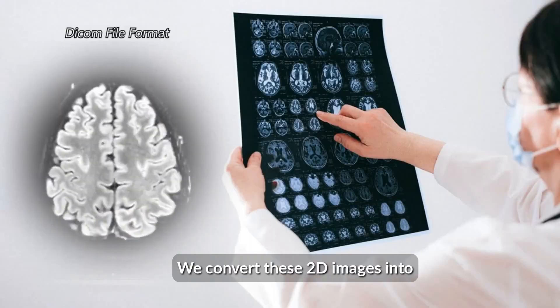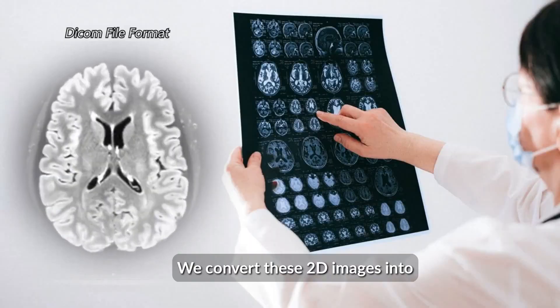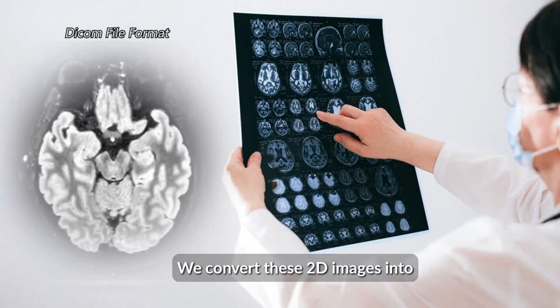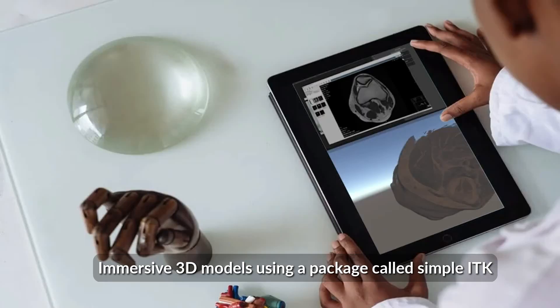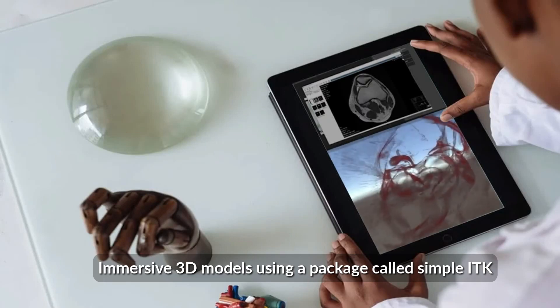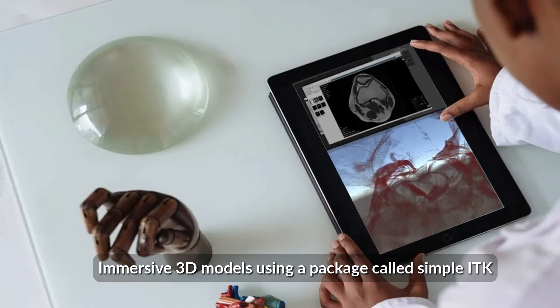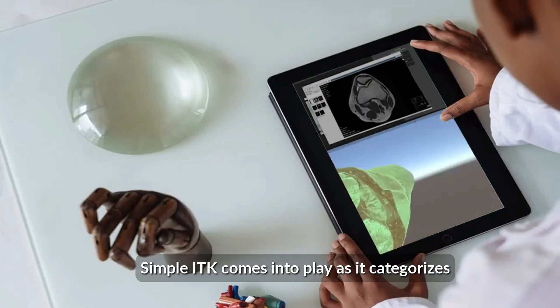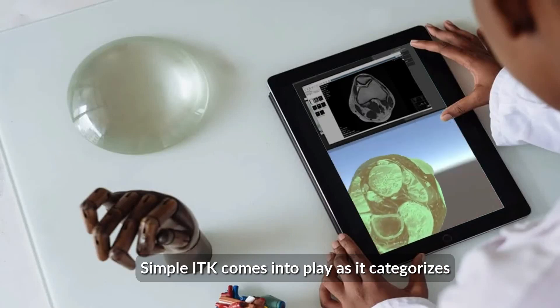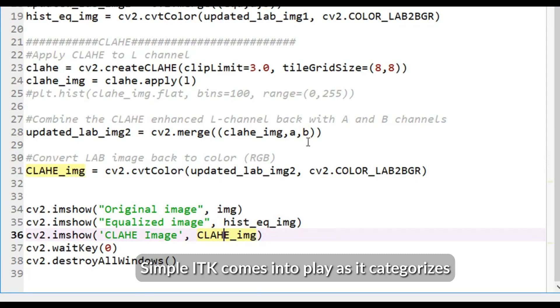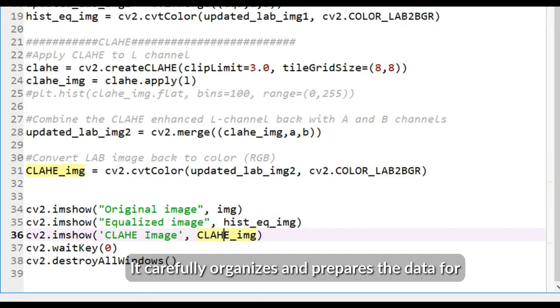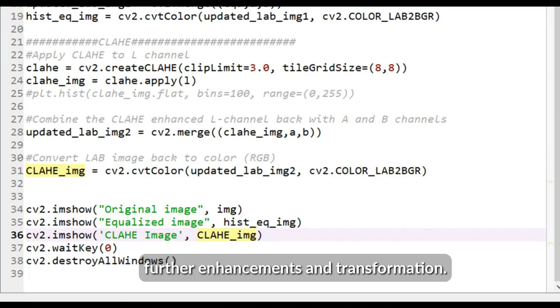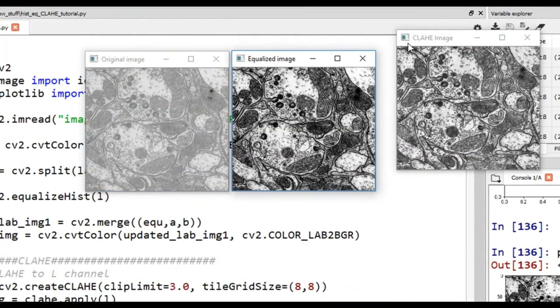Next, we convert these 3D images into immersive 3D models using a package called SimpleITK. SimpleITK comes into play as it categorizes the uploaded dataset of images. It carefully organizes and prepares the data for further enhancements and transformations.